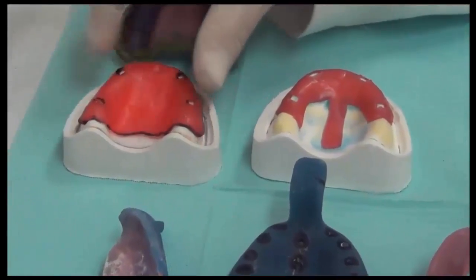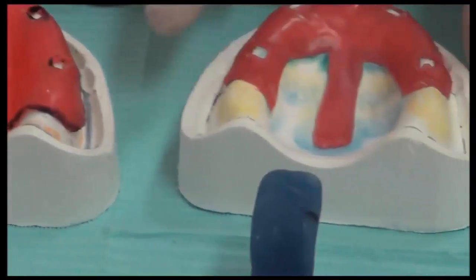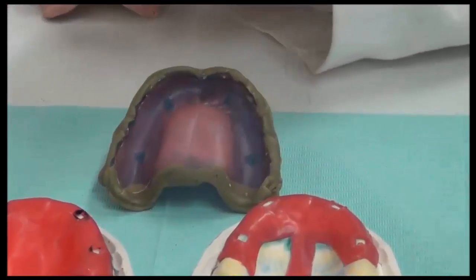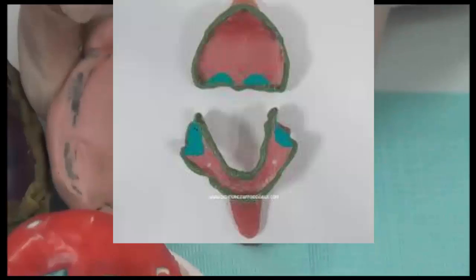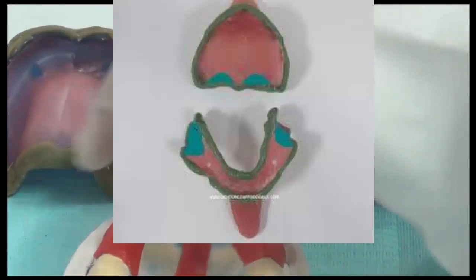Spacer, following all of the tray outline from the inside, or partial spacer. At the clinical step, we're going to remove the spacer once we take the impression. So the impression is not taken with the wax inside. The impression is taken after we have done a step called border molding.